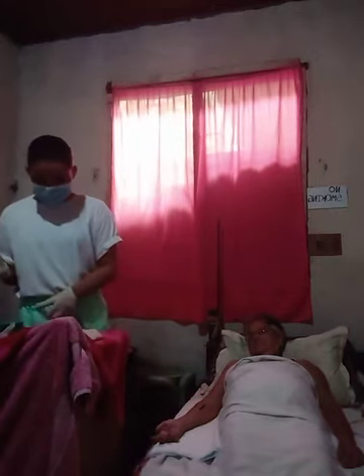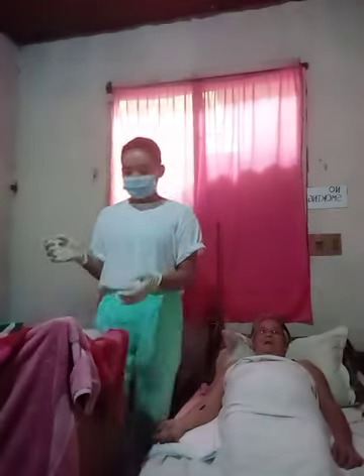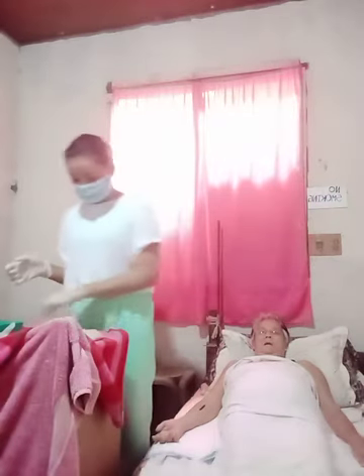After that, use dry sterile gauze in the same manner to dry the wound.